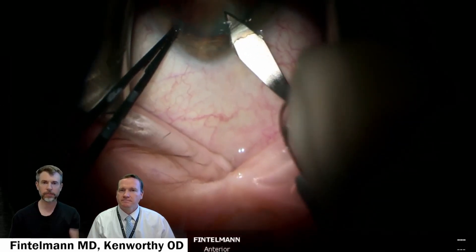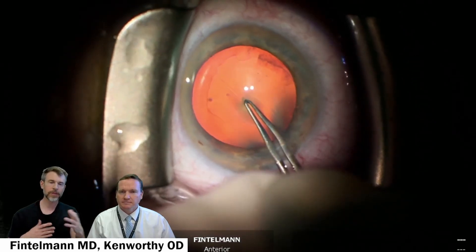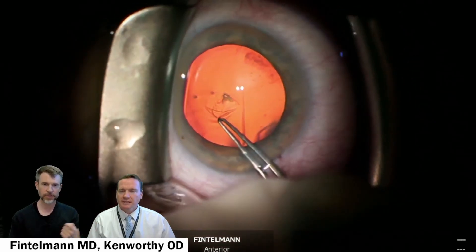This is viscoelastic, followed by the main opening with a keratome that is about 2.4 millimeters — that's at least the width.